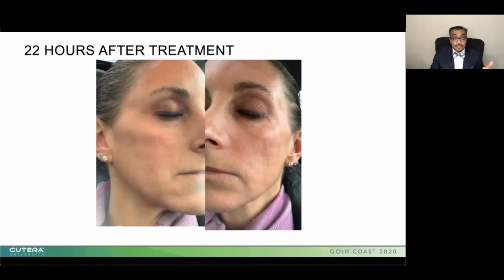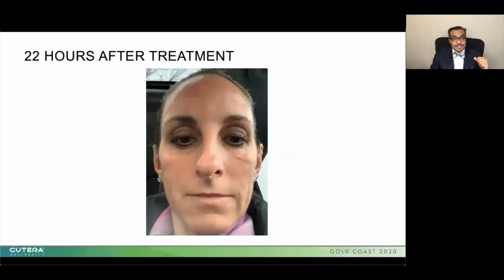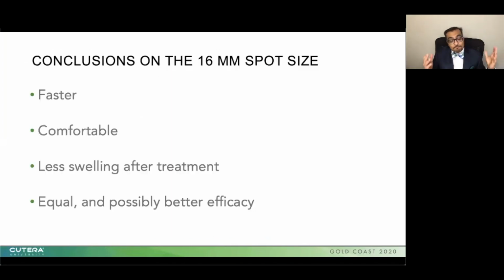So not only can you do the treatments faster, you actually get less swelling. And this is 22 hours later, both sides. So you can tell the difference in the edema. So in essence, we get a faster treatment, more comfortable treatment because the cooling allows it to be a lot more comfortable, less swelling after the treatment, and equal and possibly even better efficacy.